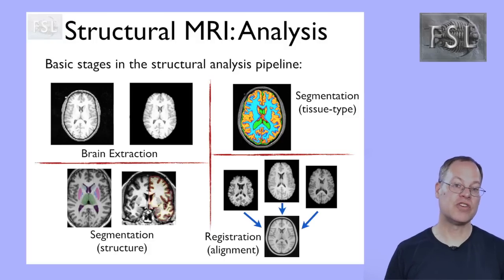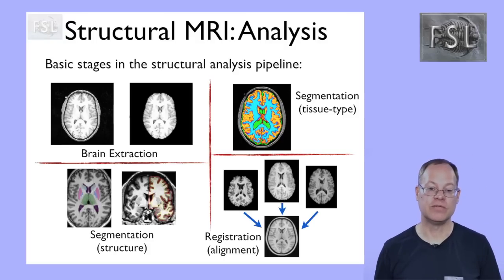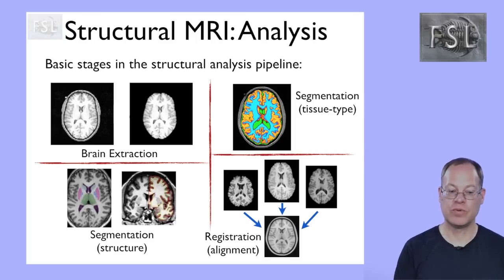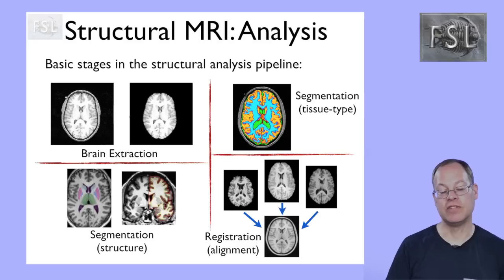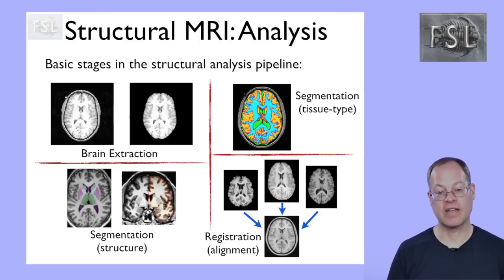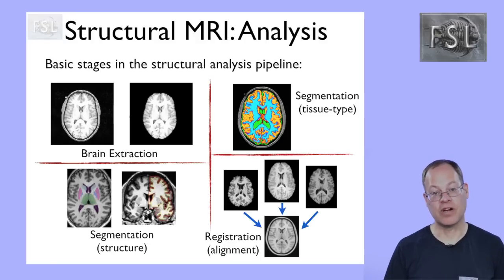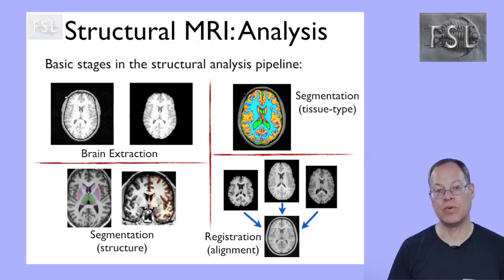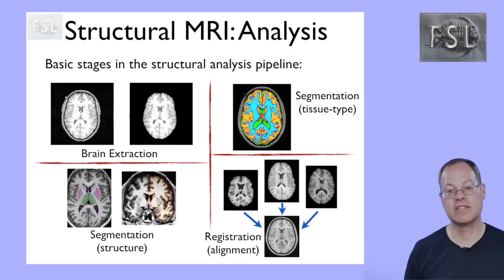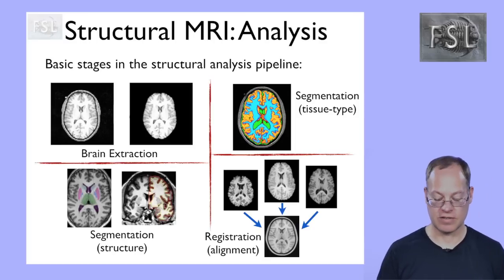And there's also registration or alignment of different individuals, and we do that in every study, whether it's between different images of the same individual to account for the amount of head motion that might have occurred during a scan, or what happens all the time, in research studies we have groups of individuals and then we have to register each of those, or align them together, so that we have a common anatomical coordinate system. We can actually say that this point is the same point in everybody's brain so that we can get some consistency in our findings.